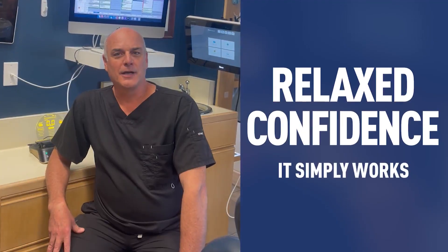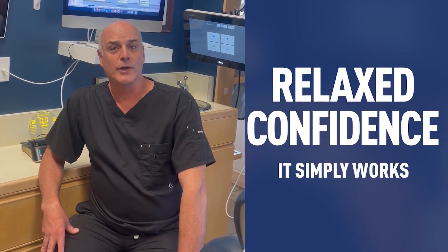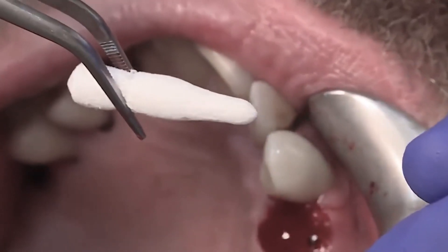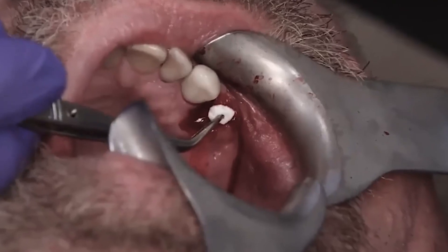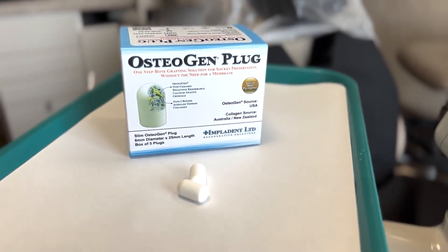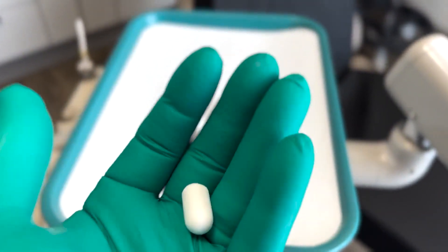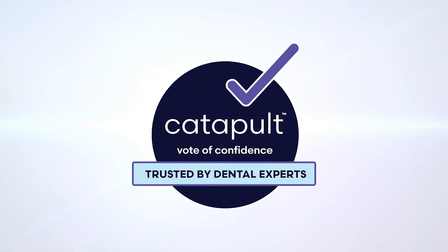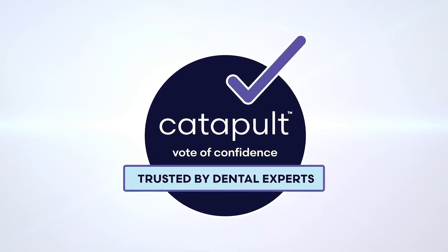Osteogen Plug gives me a relaxed confidence because I know it's simply going to work. The best thing about Osteogen Plugs is they're easy to shape, easy to place, and yield excellent clinical results. If you're looking for a dependable solution to simplify and streamline the socket grafting process, Impladent Osteogen Plug is socket grafting made simple — and deserving of Catapult's vote of confidence.